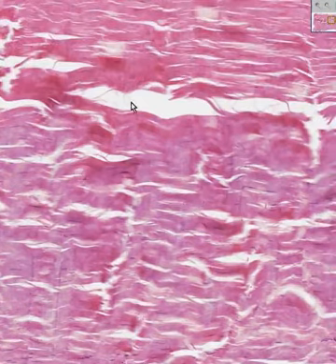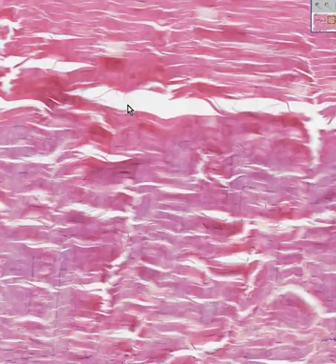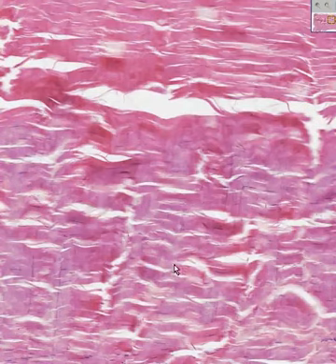Also notice, because this connective tissue is very, very dense, you're more likely to get these little open spaces, these irregular jagged spaces. And these are simply artifacts due to the fact that we are cutting more dense, more brittle connective tissue. So you're more likely to see this type of cutting artifact in dense, regular connective tissue, in other words, tendon, than we are in loose, irregular connective tissue.